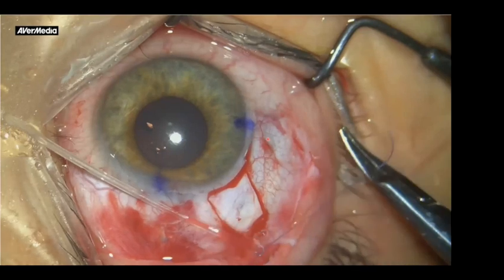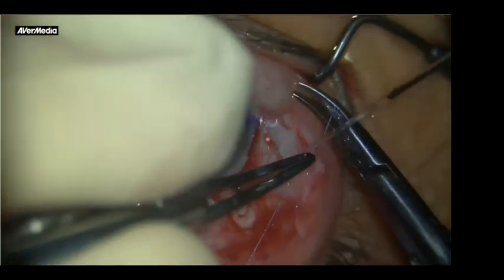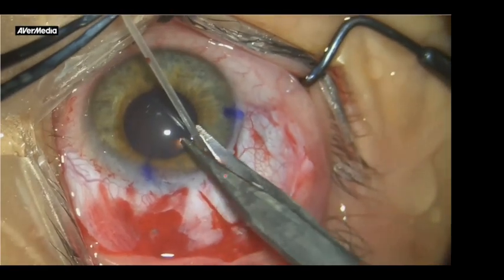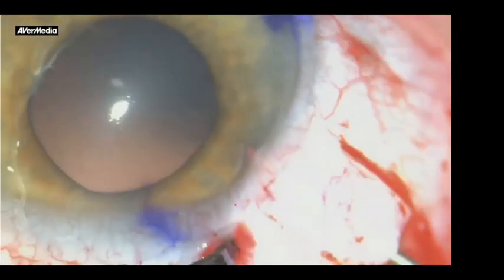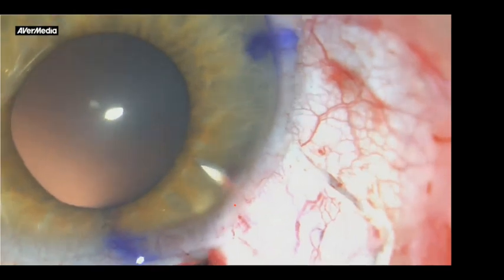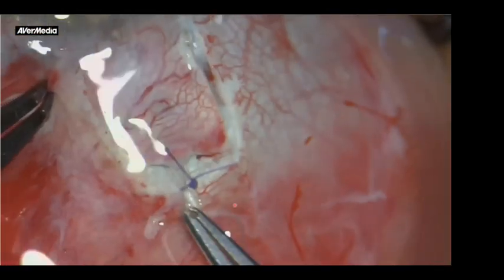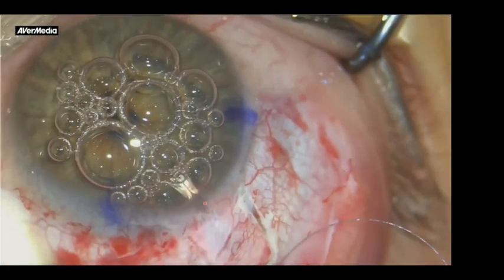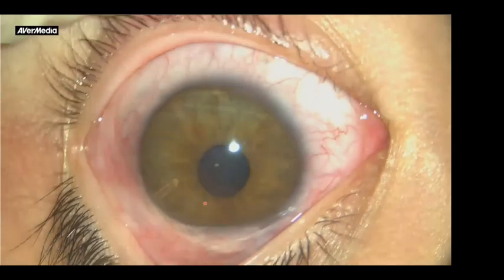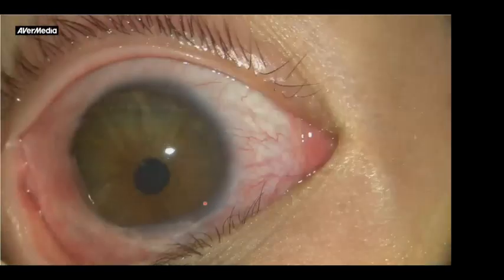So that I'm closing the tube. And some surgeons are doing a kind of perforation of the anterior part of the tube, a kind of anterior venting of the aqueous, so as not to occlude everything. So the tube is occluded temporarily here. But I'm not using it. It's so bulky that I feel in my hands that the Ahmed valve is better.